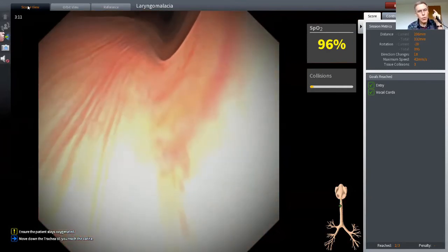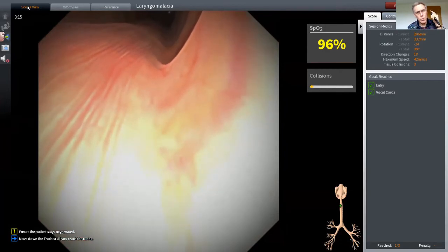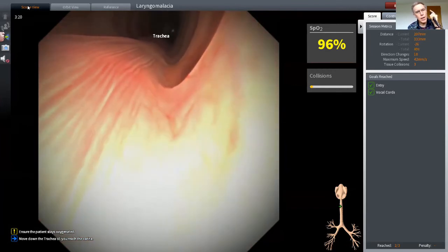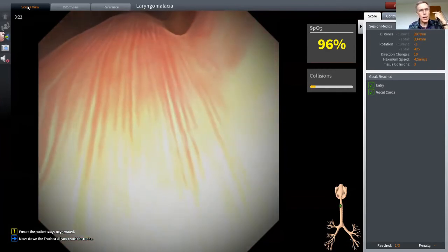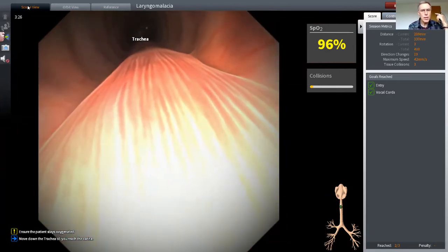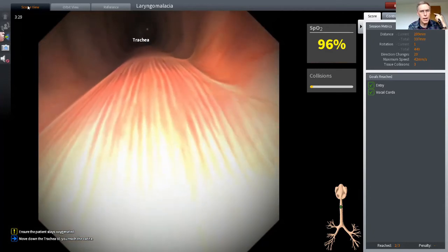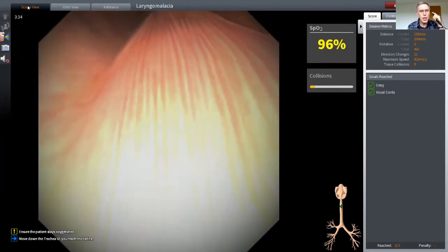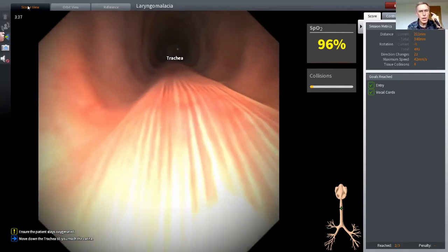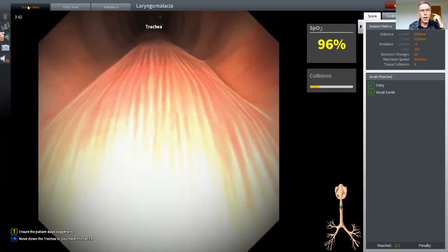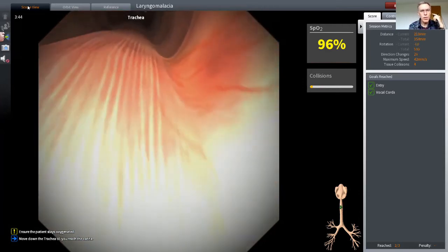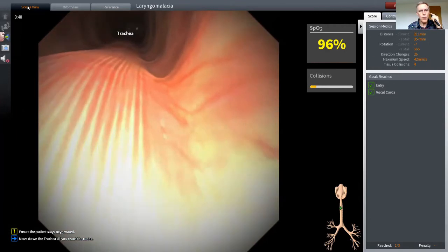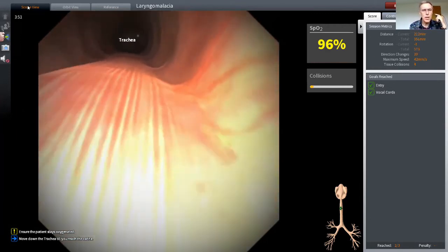Now, we all know babies are smaller than adults, and this trachea in a newborn is probably only about five centimeters long. We can see features of the anatomy on the floor of the trachea. We see striae, and that's from trachealis muscle, and it does tend to bulge upwards slightly. You'll notice also some transmitted movements from extrinsic compression by blood vessels, and you'll see characteristic breathing. The roof of the trachea is formed by tracheal rings, and there's a number of those, and of course, they're designed to hold the trachea open for breathing, unlike the esophagus, which is collapsed.